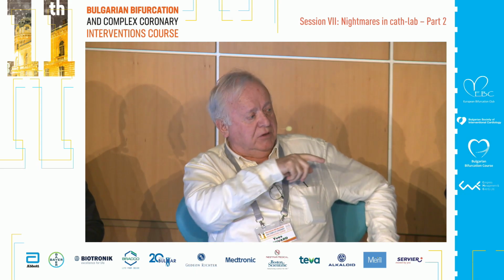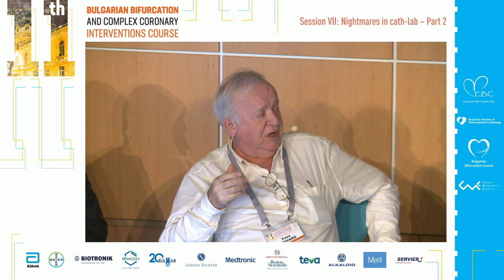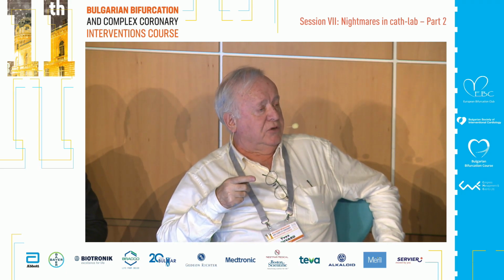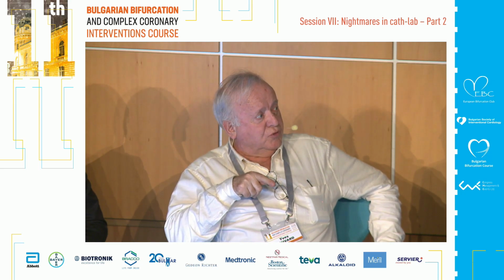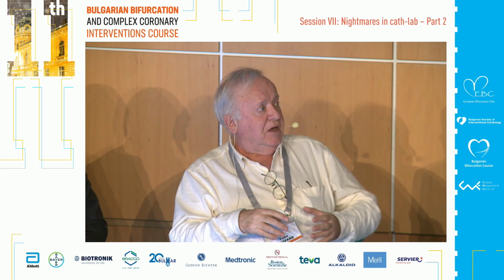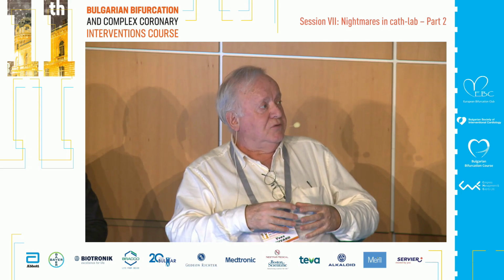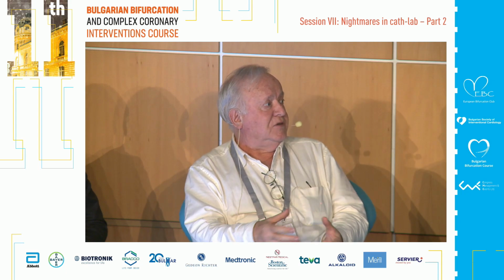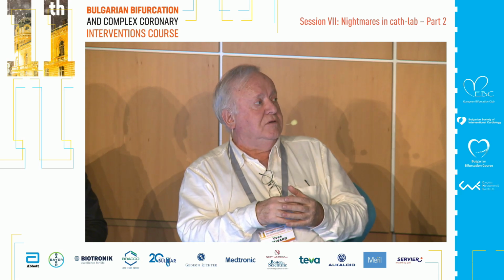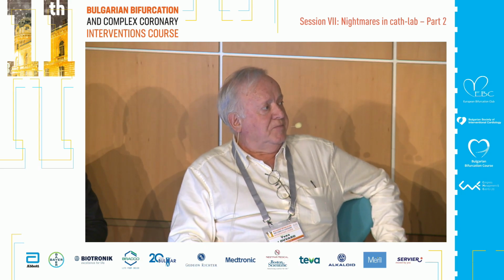Yes. On your list of treatments, to finish, there was something which was popular, and this is working for small false aneurysms: under echography, to try to go close to the hole, the entry of the aneurysm, and to inject some saline. You inflate, you inject, and a time arrives when the aneurysm is closed. And it's closed long enough not to be reopened. That's working. That's published.